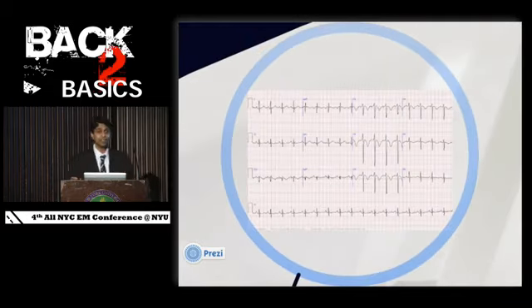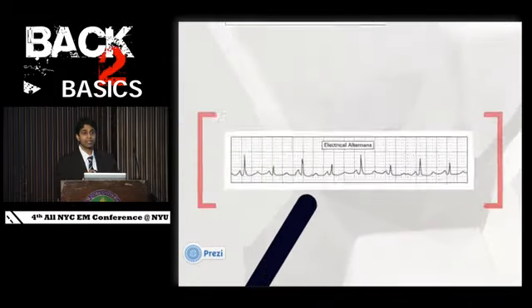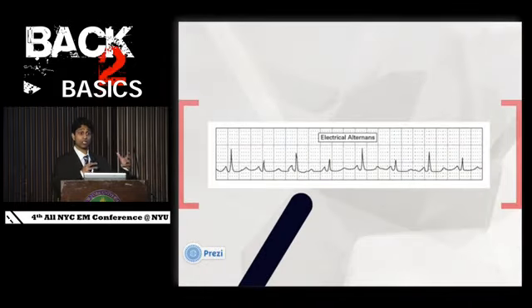All right. So if you see low voltage, you should be thinking there might be a pericardial effusion obstructing the heart, and again, you hypoperfuse the brain and you pass out. Another sign is if you see high voltage, low voltage, higher voltage, low voltage. This again is a sign of electrical alternans, and you should put an echo on the heart and diagnose their pericardial effusion, and you'll be a hero based on your EKG.